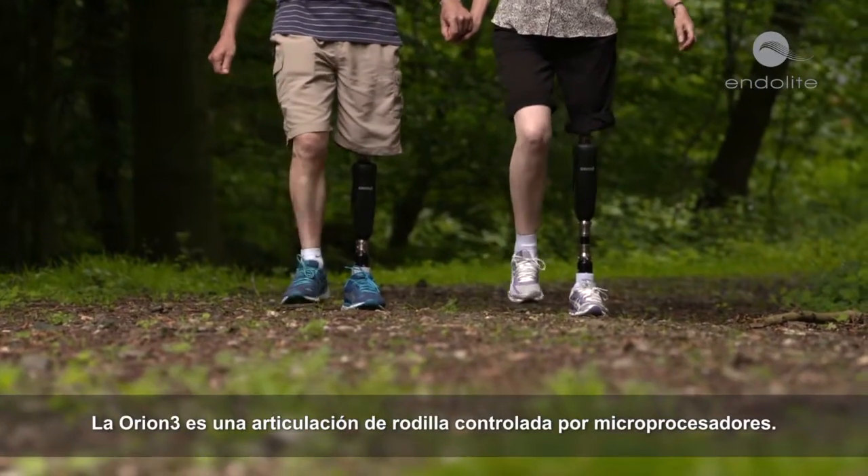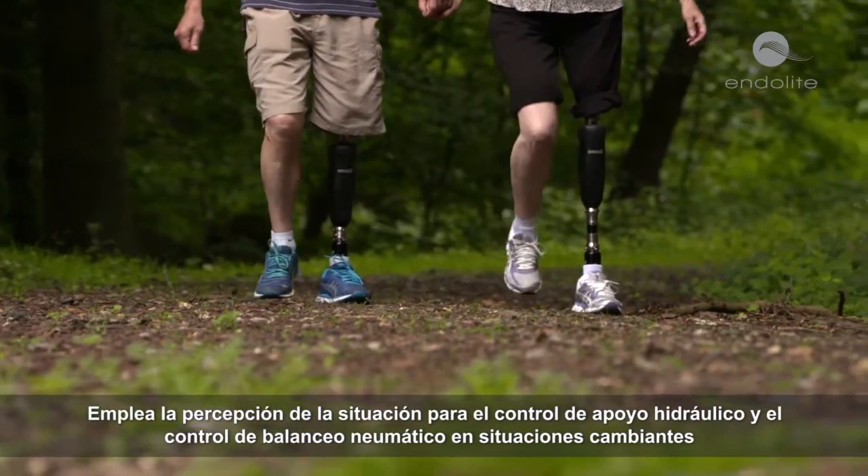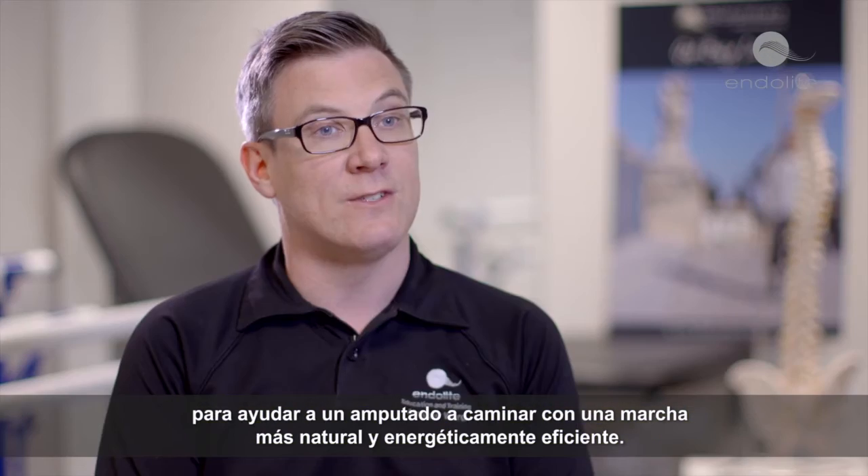Orion 3 is a microprocessor controlled knee joint. It uses situational awareness to control hydraulic stance control and pneumatic swing control for varying situations, to help an amputee walk with a more natural and energy efficient gait.